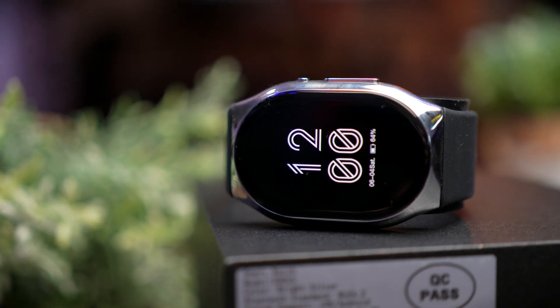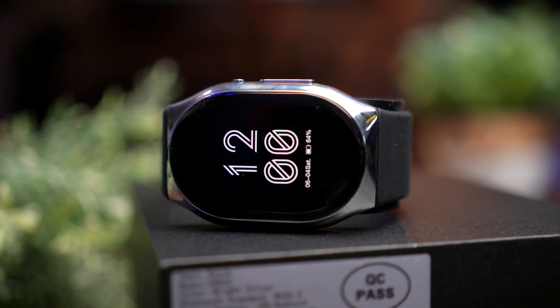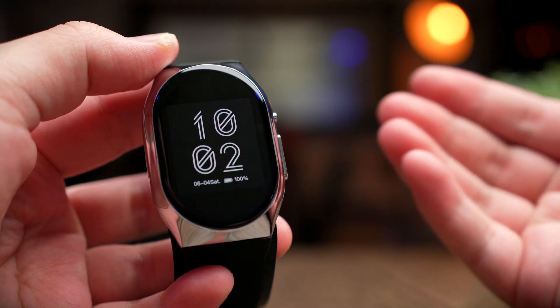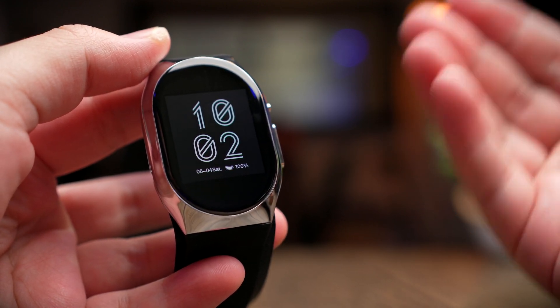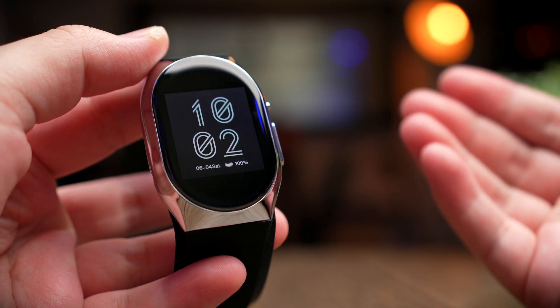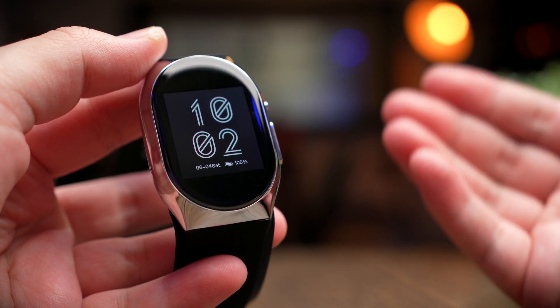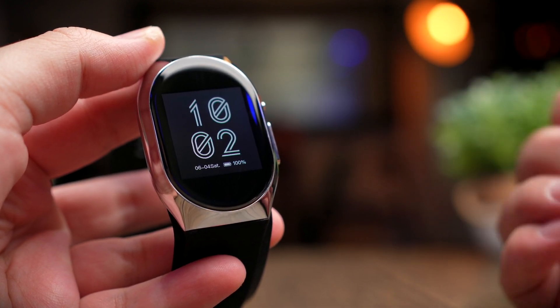Today we got a chance to try a new watch from YHE Technology, which is aimed to be a medical-grade blood pressure monitoring device. They currently have their Indiegogo campaign ongoing and have gotten quite an impressive response, so we're here today to check out this watch to see if it's any good.